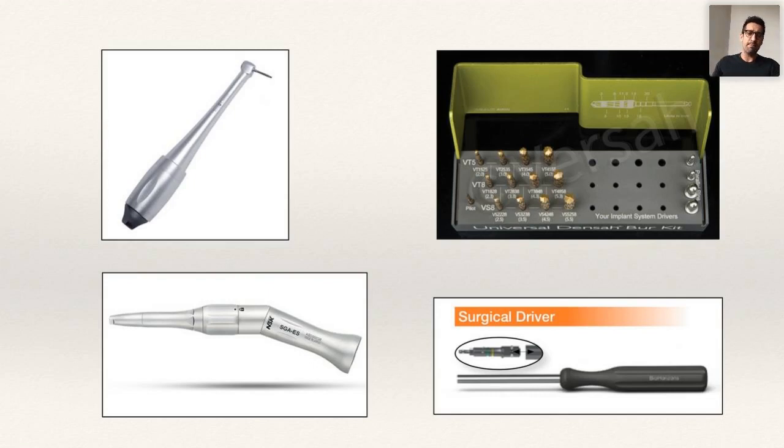This handpiece is my go-to handpiece when I do my pterygoids on the right side. So for the right side, the handpiece that you can see illustrated is the handpiece that I will use doing the right pterygoid. It makes the placement so much easier than using a contra-angle.